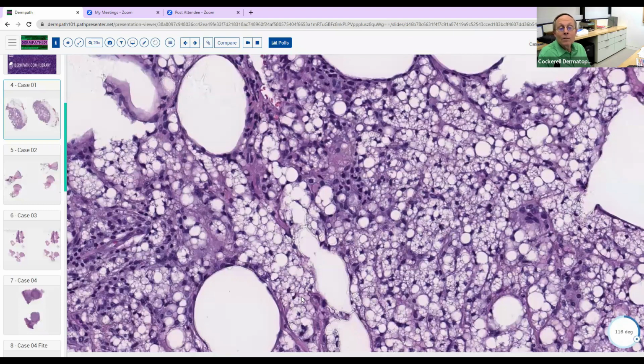All of these little tiny droplets, these little bubbles, some of them are inside cells and some of them are not inside cells. This is silicone, which is basically droplets. There's silica, which is a crystal, and that's basically glass.